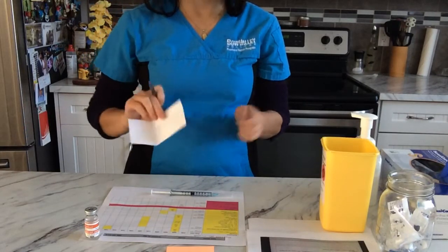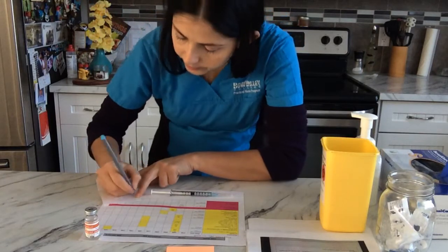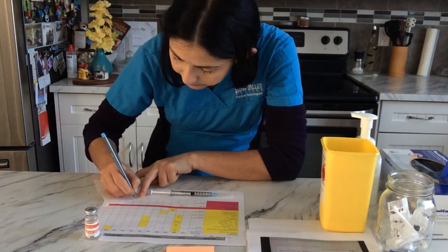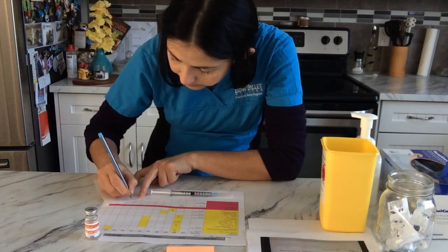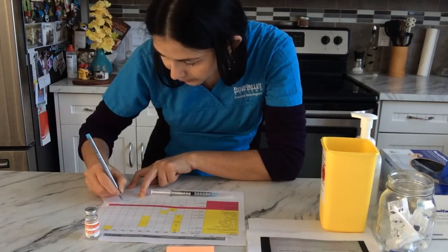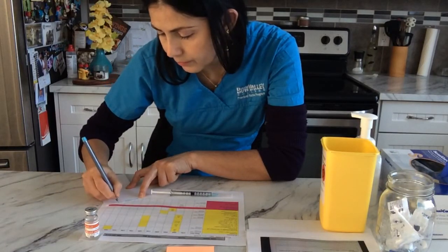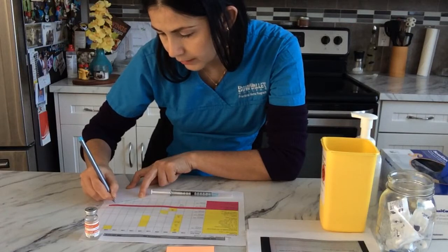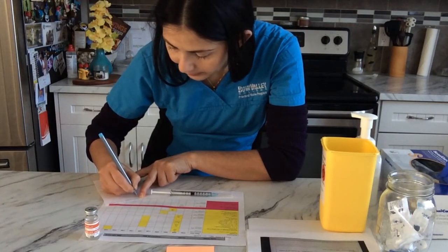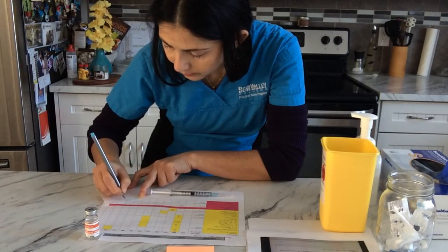Now that I have my syringe ready, I'm gonna do a label. In my label, I'm gonna write the patient's name, Parks Marta. I also gonna include the hospital ID number 121-2392. Today's date is December 1st, 2020.